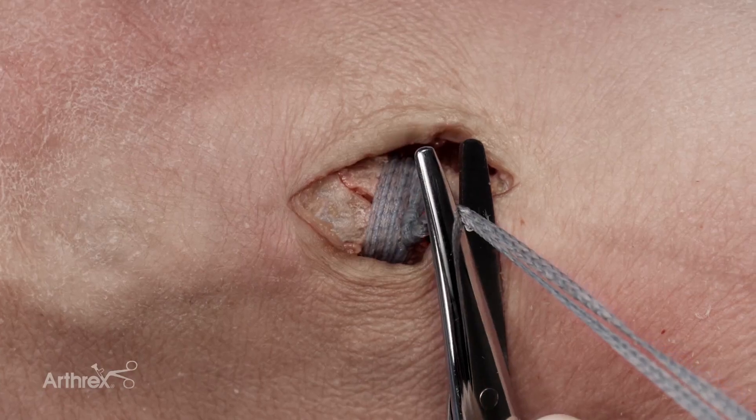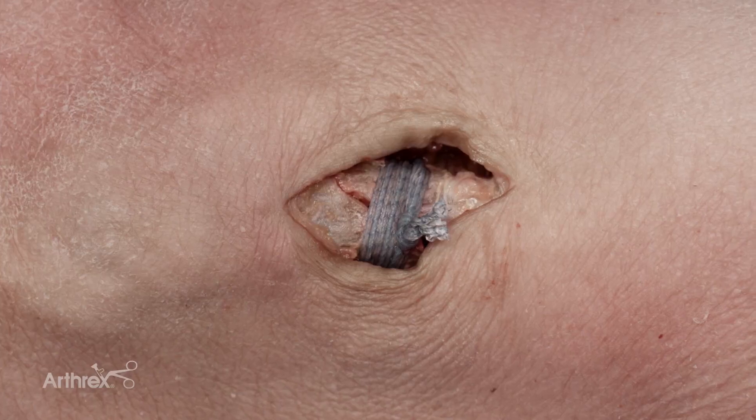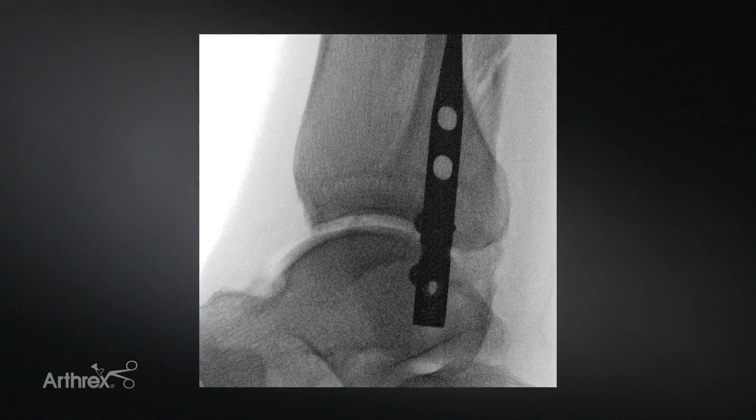I can now cut the tails of the fiber tape cerclage, and there is nothing in the way during the Fibuloc nailing portion of the procedure, making it much easier to facilitate that portion of the technique. As seen on this fluoroscopic image, the fracture site is now compressed and anatomic reduction is maintained by the fiber tape cerclage.